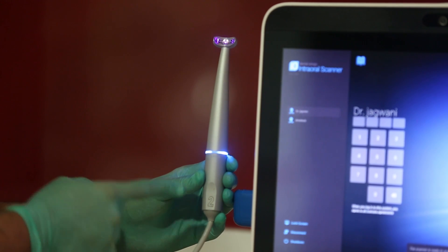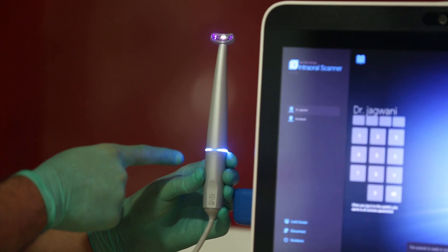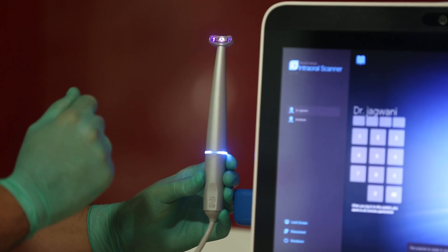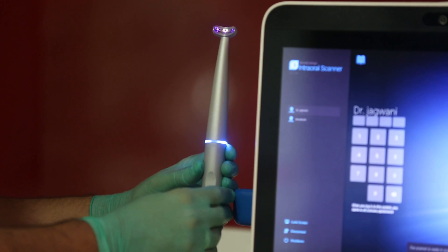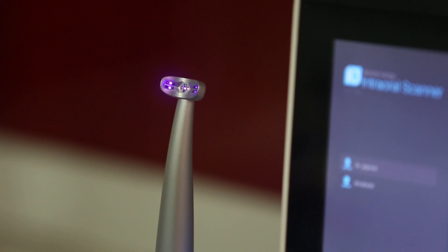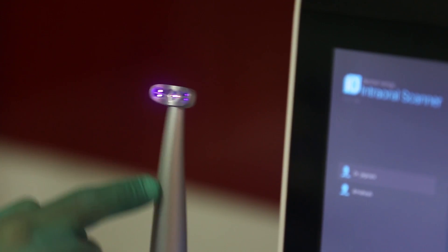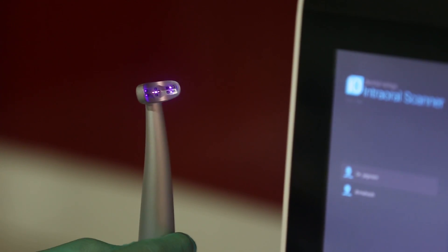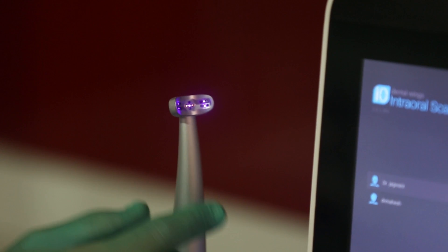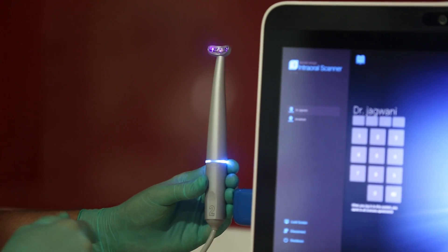Take a look at the scanning handpiece — it's a great example of technological ingenuity. Look how sleek it is. I don't feel any difference between holding this and an air rotor, and in fact it's designed keeping in mind the fact that we are so used to holding an air rotor in our daily practices. Look at that beautifully designed head which has 10 cameras and a group of LED lights — this handpiece is an absolute engineering marvel.